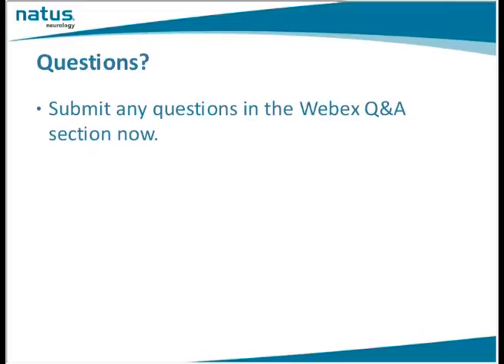Katie, does another company have the ability to monitor the basilar? Not that I know of, Donna Lee. I guess it is important to be aware that you can monitor if the patient is having posterior symptoms. We could do the basilar, but like you're saying, you just have to hold the probe. Half an hour doesn't sound like a long time, but 30 seconds doesn't sound like a long time when you're holding your breath. It really is hard on the wrist.